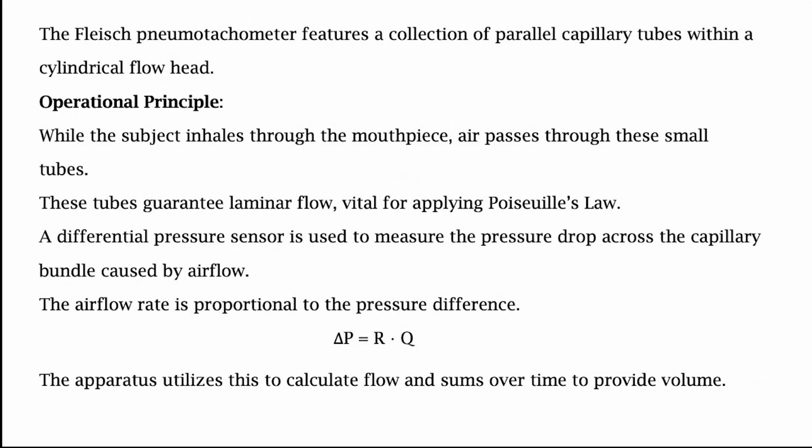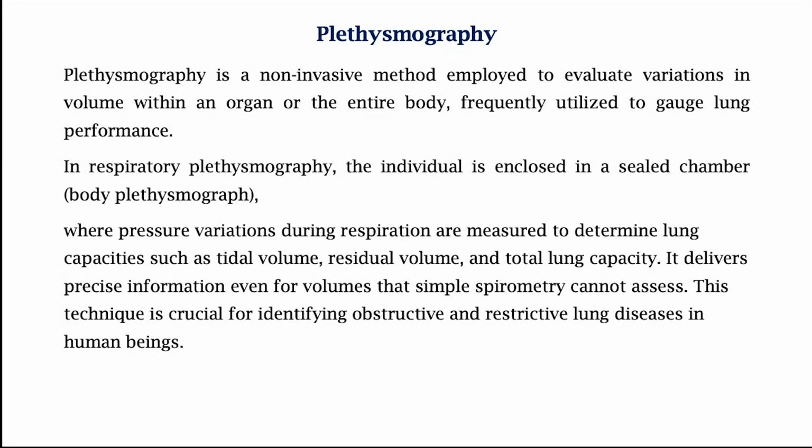So we have already seen this, and then we'll move on to the next topic, which is plethysmography. In this method, our interest is to measure lung volumes by finding out pressure differences. How are pressure and volume related? If a person is breathing inside a sealed chamber and I am measuring the pressure change due to the patient breathing, I can essentially find out what the volume is.